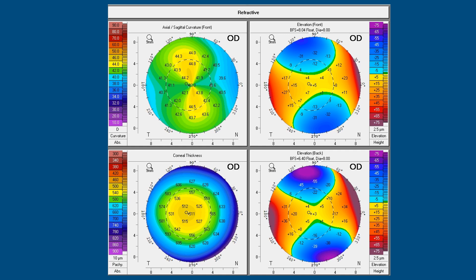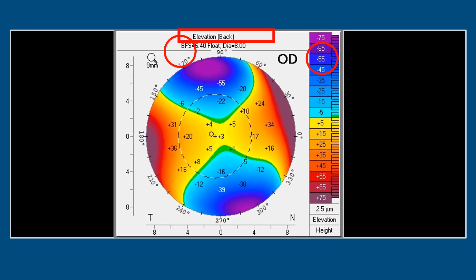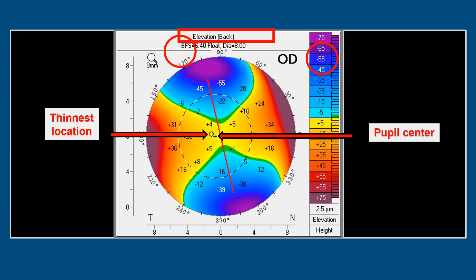Now we go to the elevation maps. The posterior elevation map shows the back of the cornea in comparison to the best fit sphere — not the best fit toric ellipsoid, which is explained in VPL 1.1. The arrow shows the direction of the steep axis, the plus sign is the pupil center, and the black circle is the thinnest location. The values plus 10, plus 5, etc. indicate how much the surface is elevated compared to the best fit sphere.